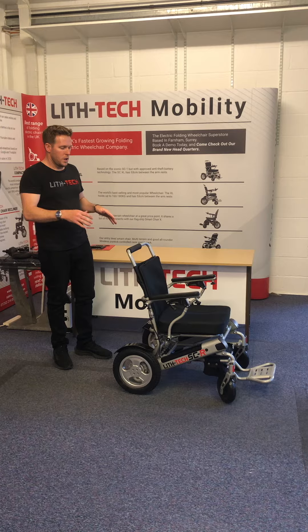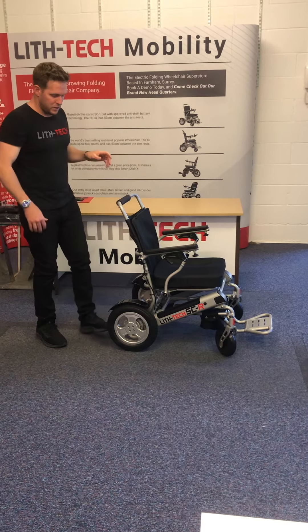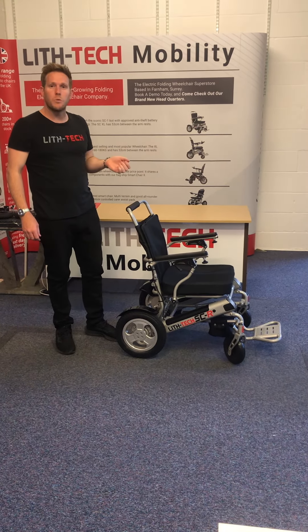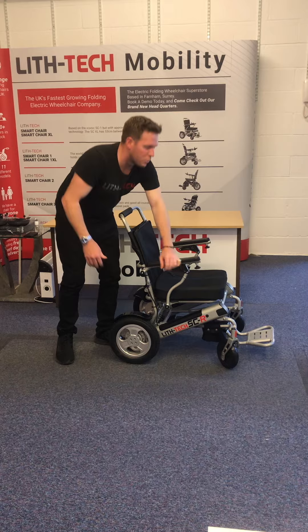I'm just going to walk you around this chair. You've got your 12 and a half inch rear wheels at the back — completely solid, puncture-proof tyres. Literally the best tyres you can buy anywhere in the world. Nice and grippy, harder wearing, making for a much smoother ride. No punctures anymore as well.